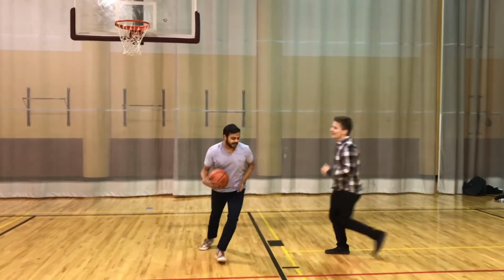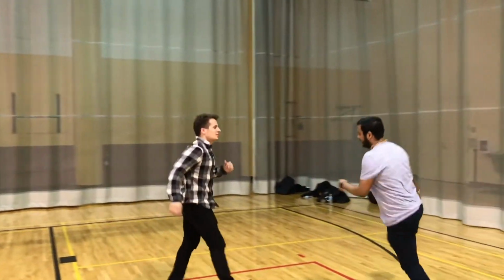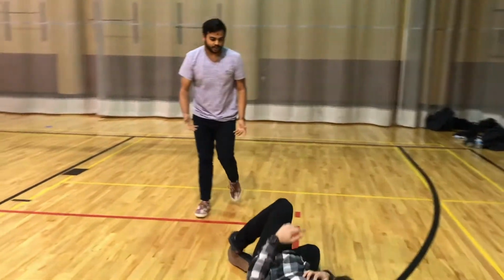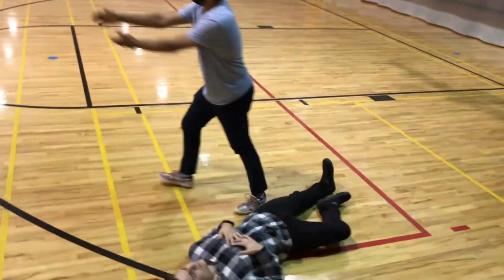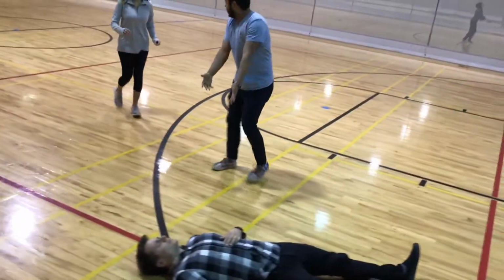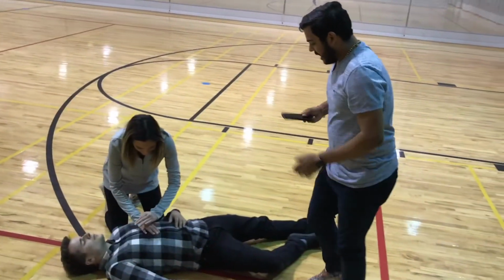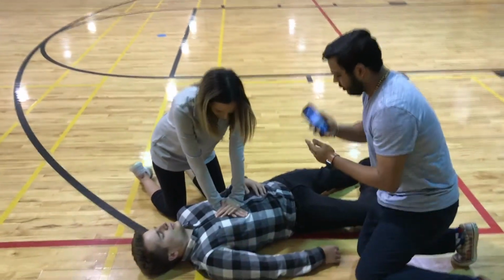Let's stop. Go down. Go down. Go. What's wrong? Dude, are you okay? I don't know. Just collapsed. I don't know what to do. He doesn't have a pulse. I know CPR. I'll call 911.